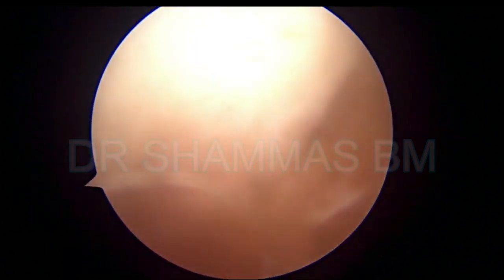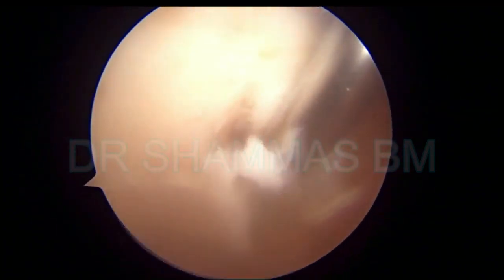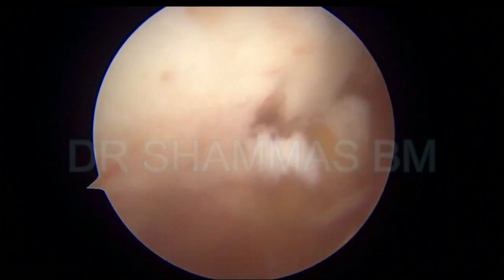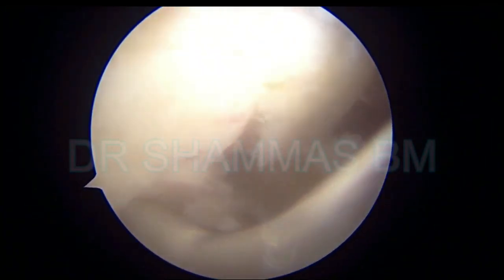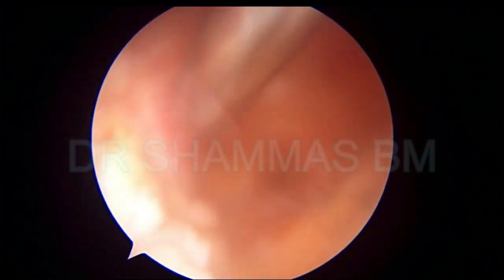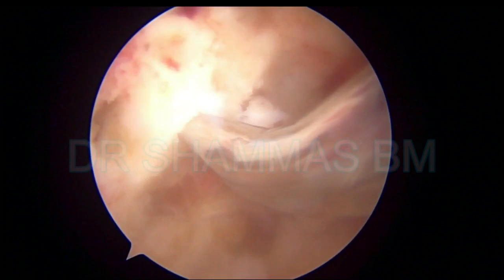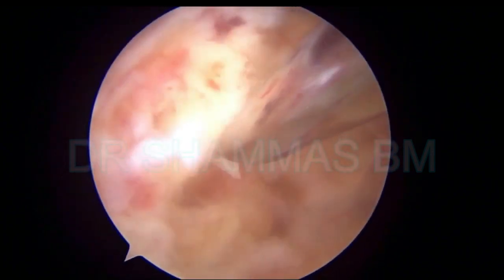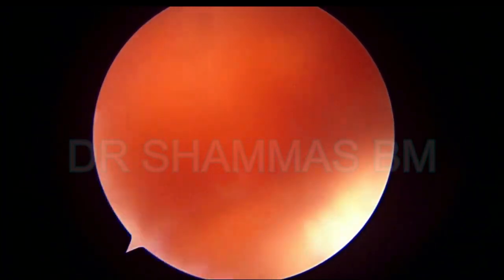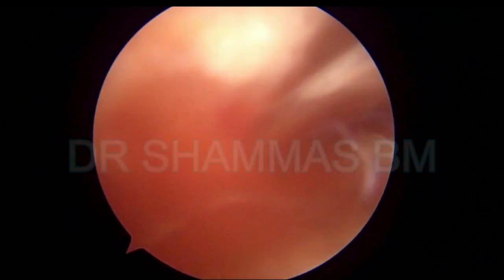All this is being done arthroscopically — you don't have to open the joint. If in this case you had to open the joint it would be a disaster for the patient, because it would go into infection as the skin condition is very bad. In this scenario, arthroscopy helps you a lot in attaining fusion of the joint. The chondropic is being used for putting multiple punctures in the tibia and the talus. See — the bleeding is coming from the punctures that you have made. That is a very good sign.